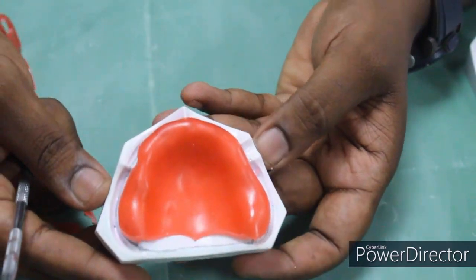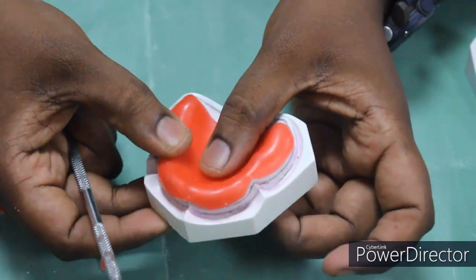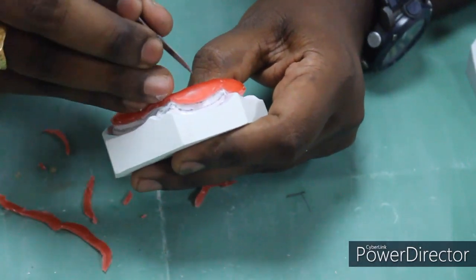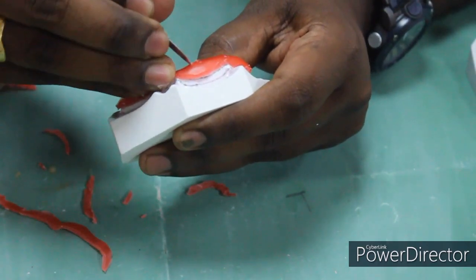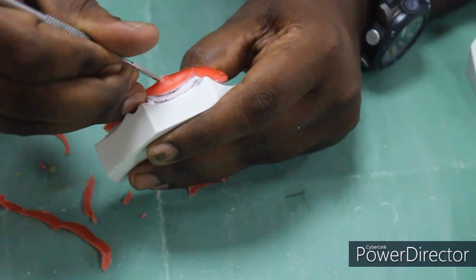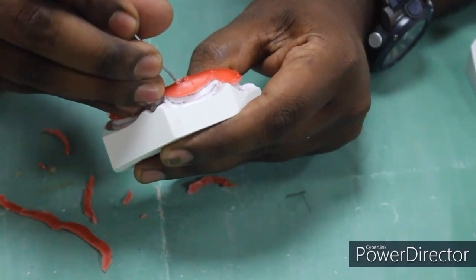Now the wax has been adapted up to the proposed spacer line. In addition to it, we are going to incorporate the stopper, that is 2 mm by 2 mm dimension, one in the canine region on both sides.